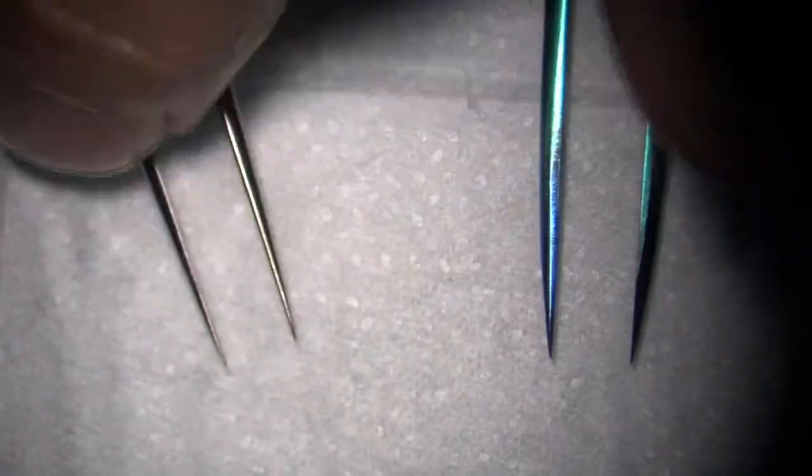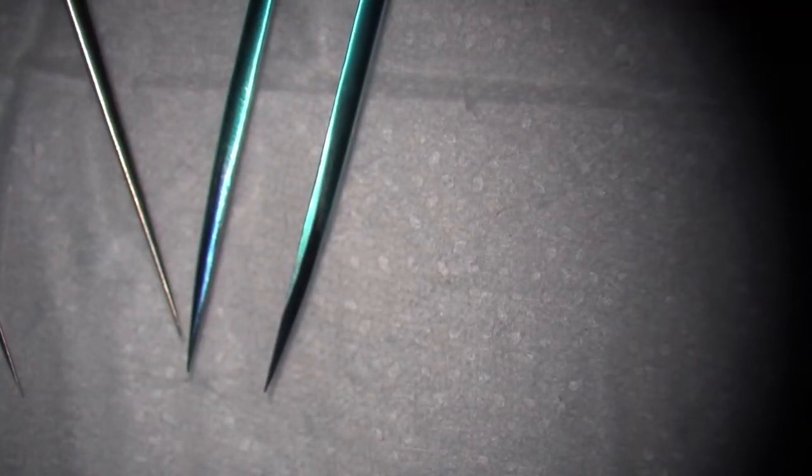This rainbow forceps, you can see the number from here, 0.03 or 0.05. This is now the smallest forceps we have in the OR. You can see it's well designed. This forceps is pretty much just straight, right? This one, you can see, is like a clamp of the highest quality, like a crab claw. This one can pick up very fine structures very well. It's designed based on the requirements of super microsurgery, by the father of super microsurgery, Koshima. So it's designed by a super microsurgeon, and it works very well.